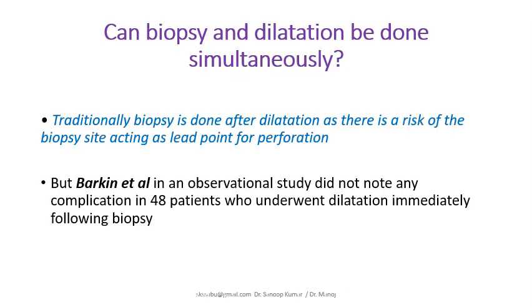Can a biopsy be done before dilatation? This is a discussion we had in SG dilatation also. Traditionally, we say biopsy should not be done before dilatation. It can cause perforation, but there are controversial studies which tell that there is no increased risk for perforation. So this ends CRE and balloon dilatation.